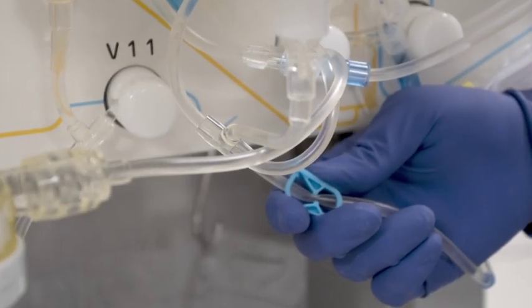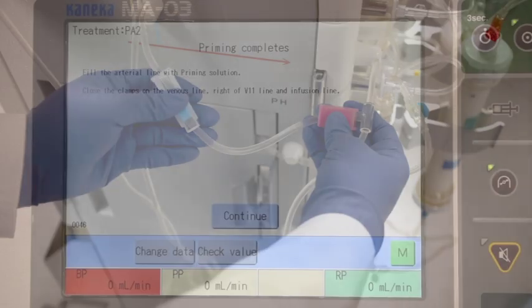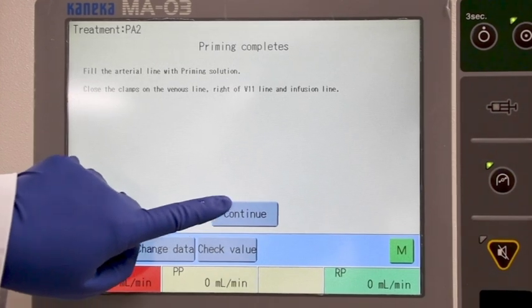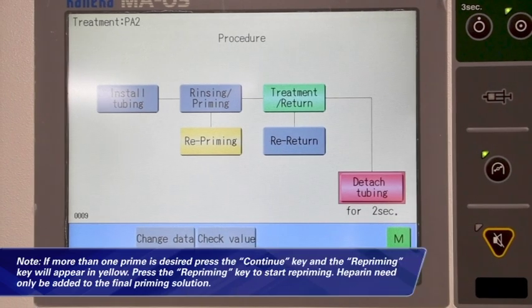Clamp with the plastic hemostat and hang on the left side of the machine. Close the blue pinch clamp to the right side of V11. Close the roller clamp and red pinch clamp of the infusion line. Press continue — the procedure screen will appear. Note: if more than one prime is desired, press the continue key and the re-priming key will appear in yellow. Press the re-priming key to start re-priming. Heparin need only be added to the final priming solution.